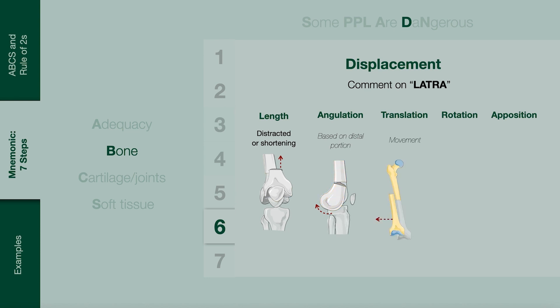Translation. Determine if the fracture has moved on the horizontal plane, medially or laterally. This is an example of lateral translation. Rotation. Comment if there is any rotation as shown here. Apposition. Ask yourself: do the ends meet? Comment using terms such as good apposition, partial apposition, poor apposition or no apposition.